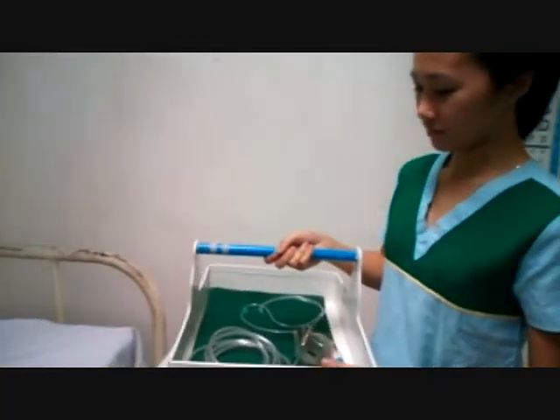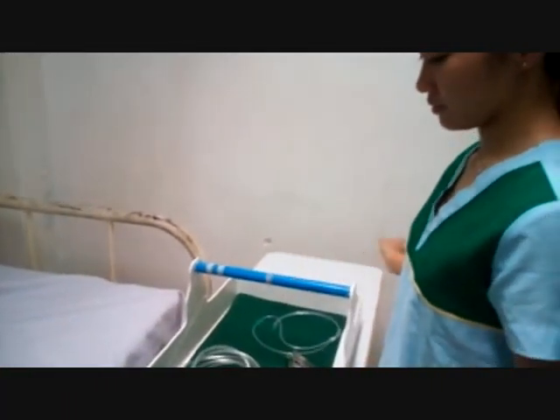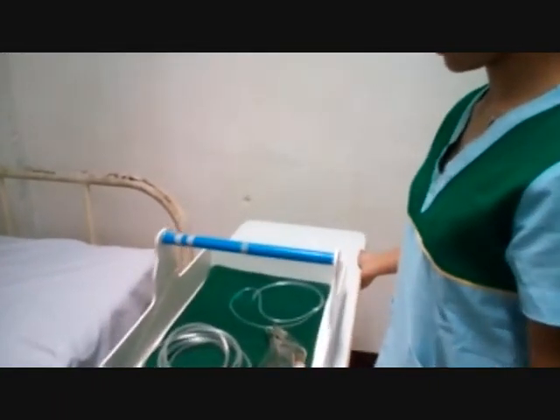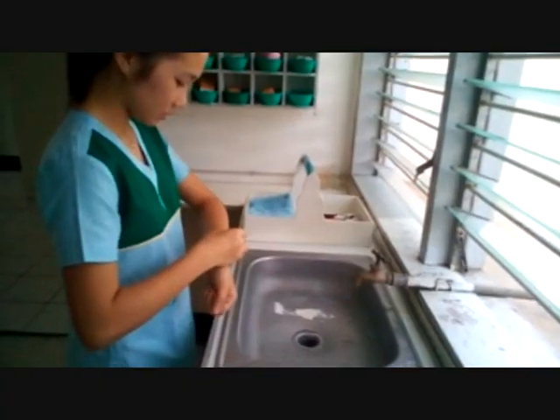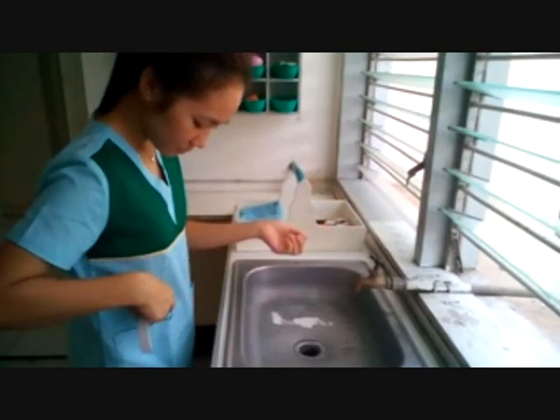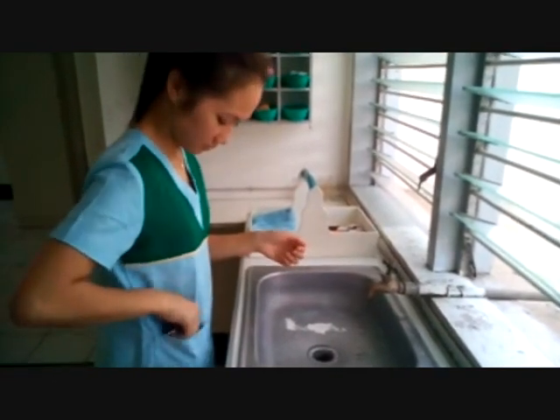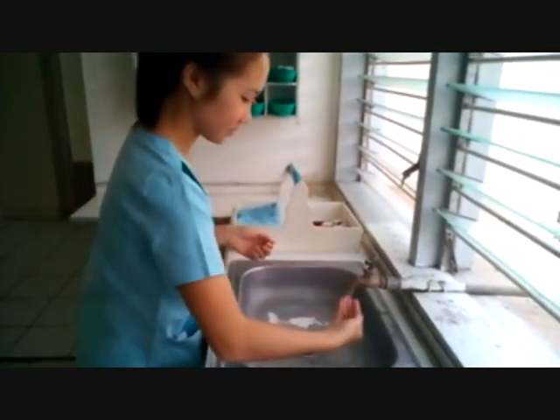Bring necessary equipment to bedside stand or over bed table. Perform hand hygiene and put on PPE if indicated.